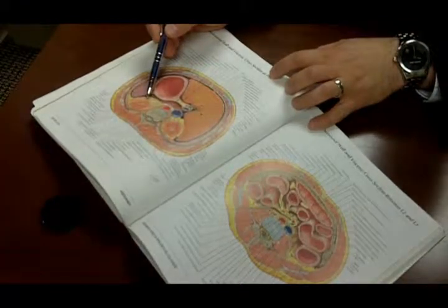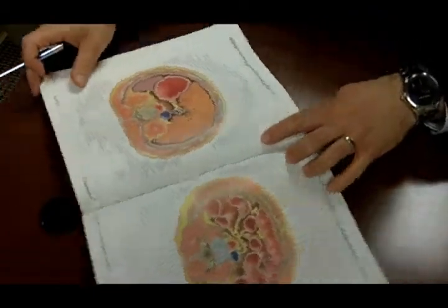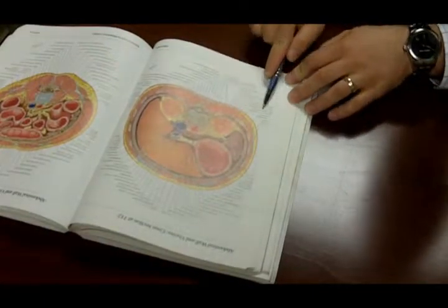In the retroperitoneoscopic adrenalectomy, the patient would be laying this direction so that the port sites would be here, here, and here. The major advantage, I think, is that during retroperitoneoscopic adrenalectomy, the abdominal cavity is never entered at all. And so, as a result of this, patients have much less postoperative pain. Many of my patients have not required any narcotic medication after surgery.